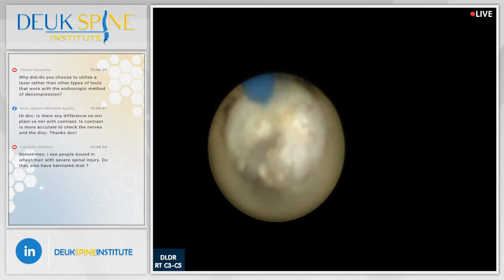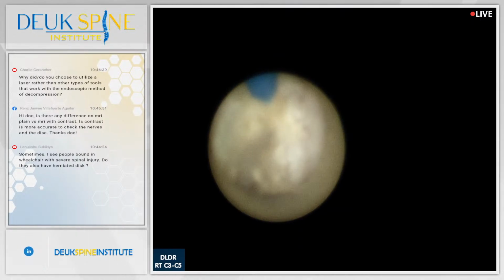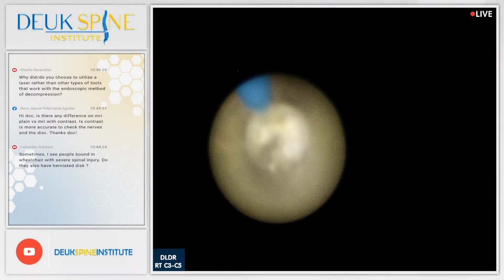May need a new cervical scope, unless that's water. Well, could be water.